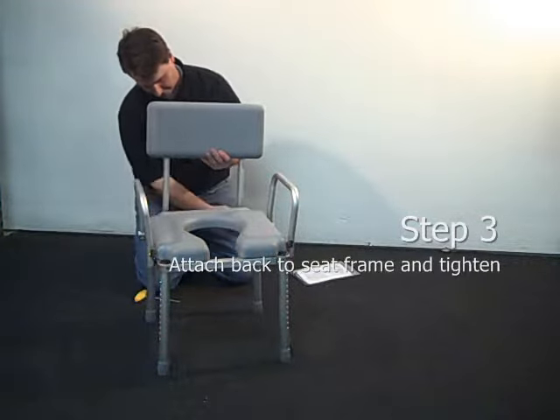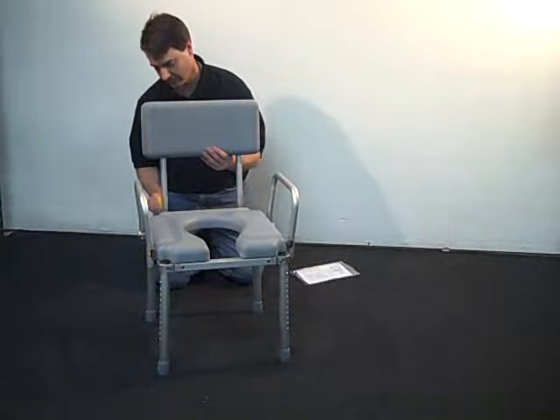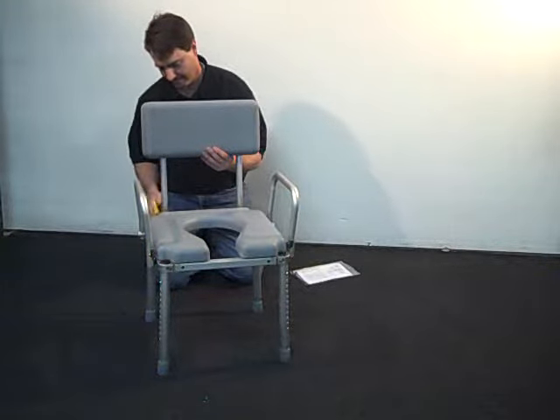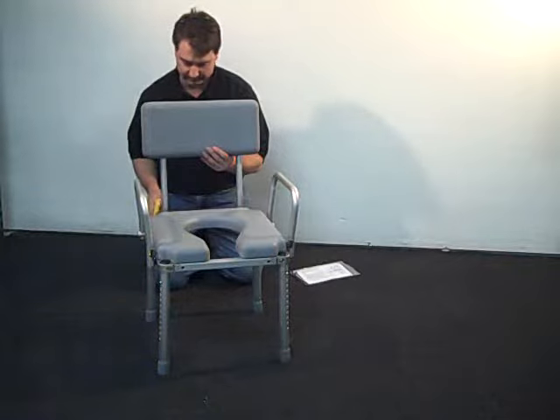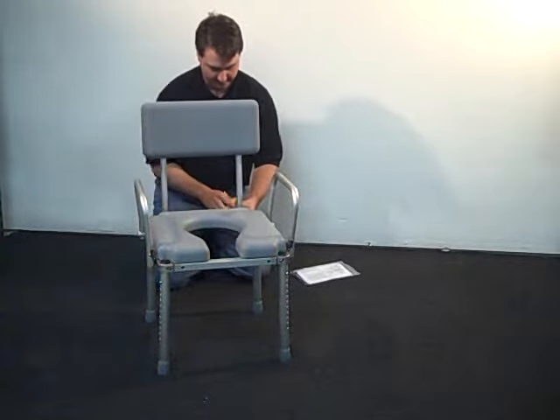Once the arms are installed, the next step is to install the backrest assembly. It has two threaded bolts attached to the back frame tubes. Position the backrest with both bolts and then tighten the bolts using the quarter-inch Allen wrench provided.